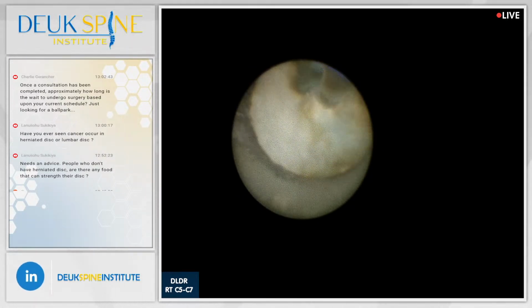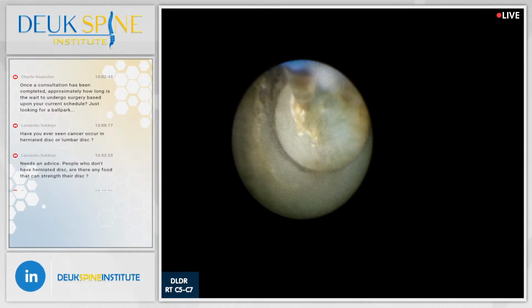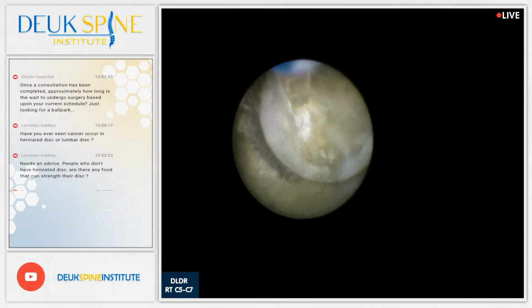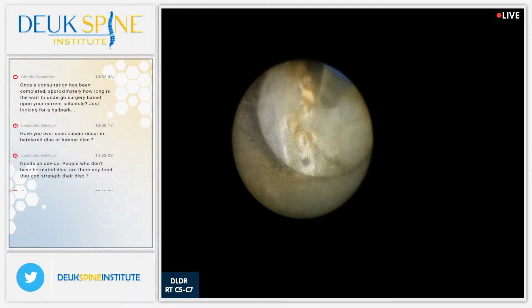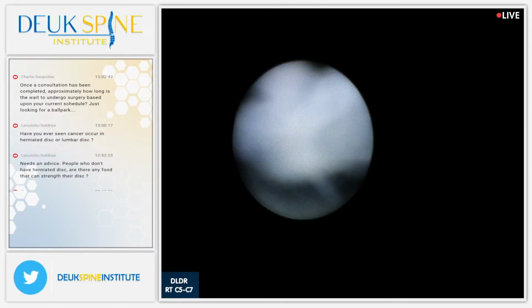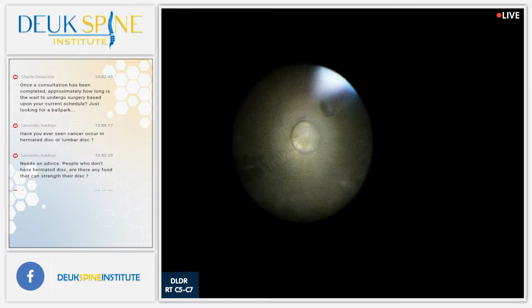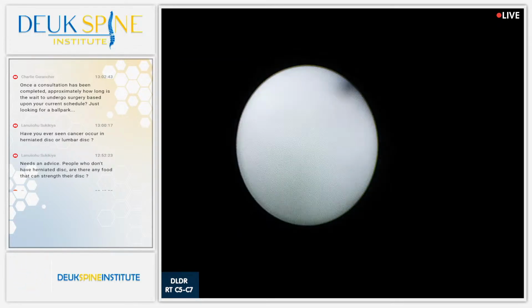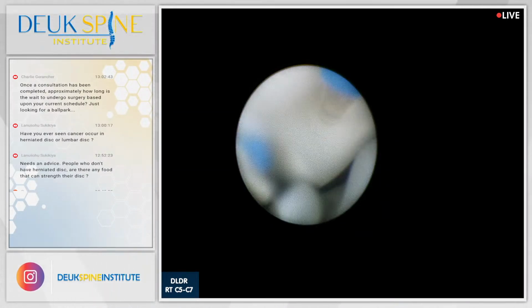All right, just about done. I'm really surprised at how much herniation's here. On the MRI, it didn't look this bad. I think he's gotten worse. He may have done something more recently, but the herniations just keep coming. Let's go back and look the other direction. Again, this is C6-7. There's another piece. That one came out nice and easy.